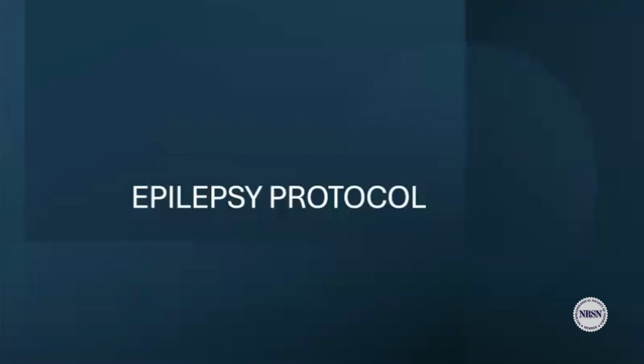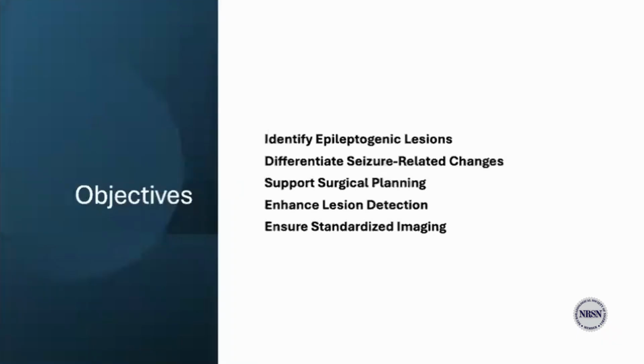And then next, we will look at the epilepsy protocol. The epilepsy MRI protocol is tailored to help us get the clearest possible picture when evaluating patients with seizures. First, it aims to identify epileptogenic lesions, those subtle abnormalities in the brain that may be responsible for seizure activity.